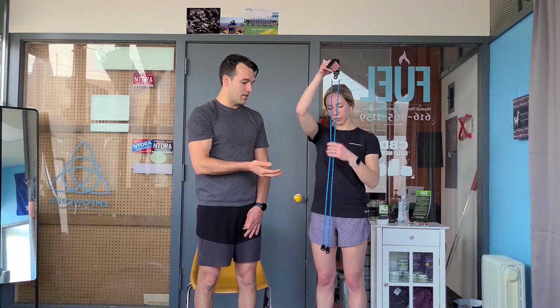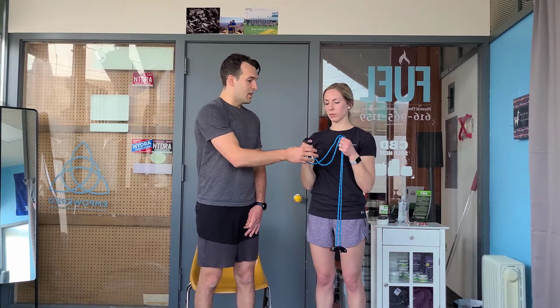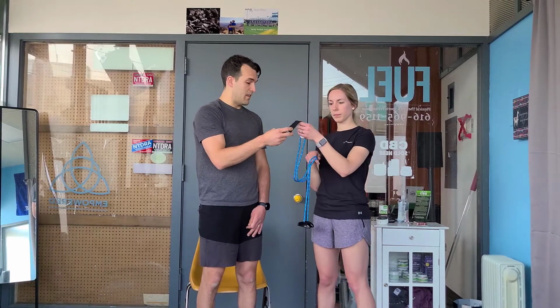Pretty cost effective. It cost us about $6 or $7. You don't need anything fancy. What we like about this is that it's got a little knob. You hook this right over the door, and Haley's going to show how to set that up.